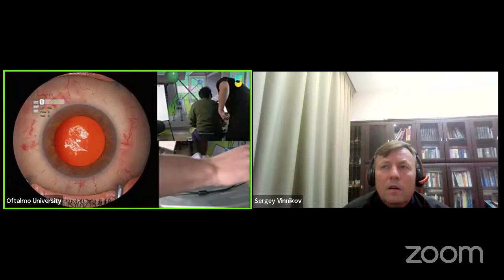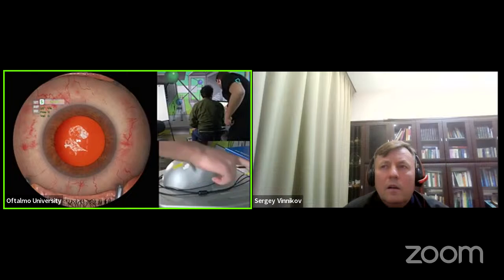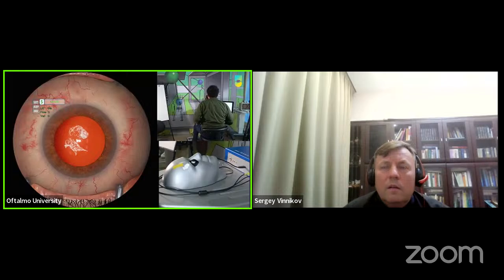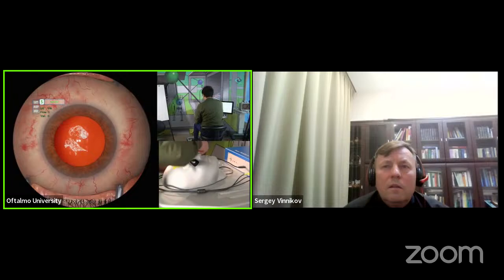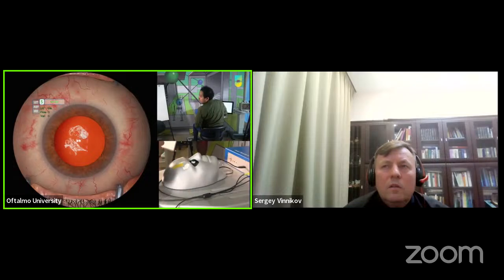Okay, so again, this is not about getting it right, and he is actually not training how to do this. The only objective here is to see what makes more logic in the beginning and what is the most common mistake we make. He has the posterior capsular break, vitreous in the anterior chamber, and already viscoelastic. So he's going to need to enter with irrigation and the anterior vitrectomy. Let's see how he does, and let's see the metrics that the machine is going to give him.